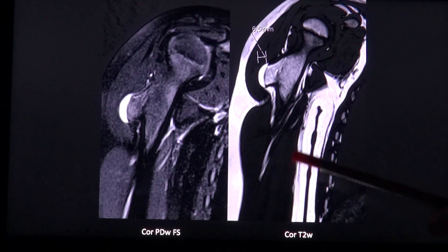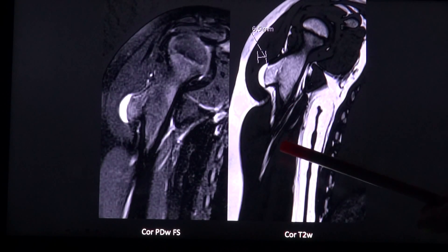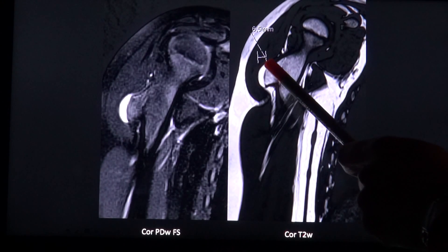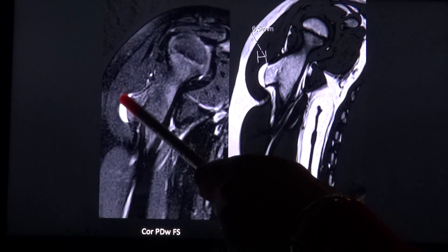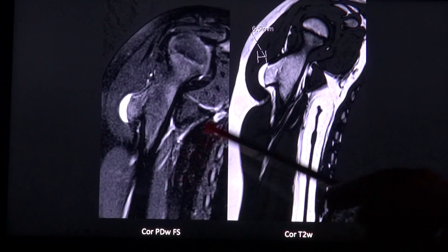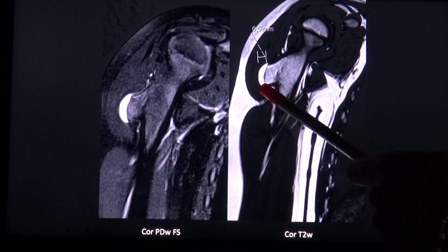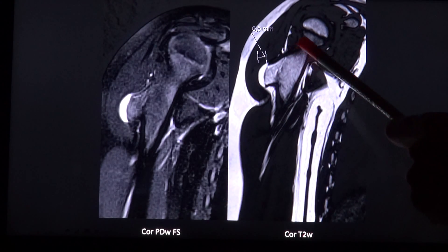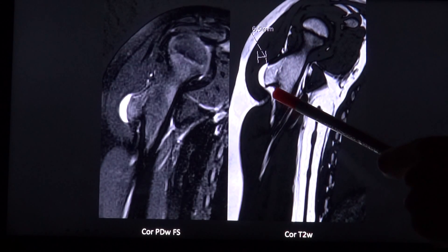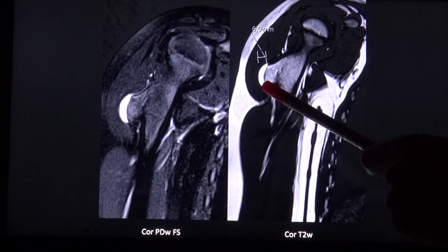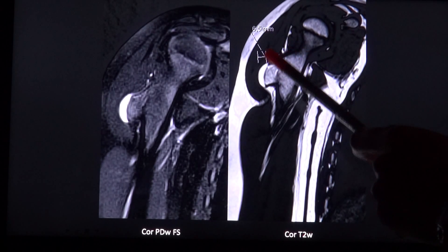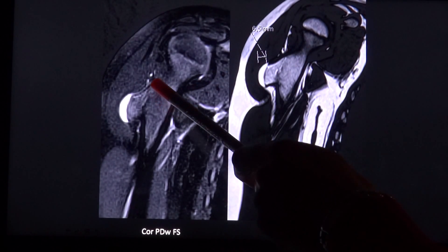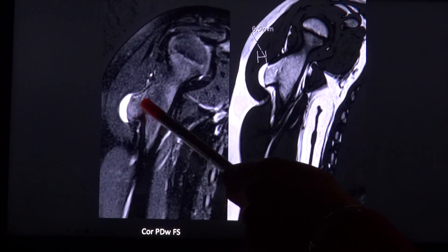With an MRI scan you can better evaluate the cartilaginous cap. Here with a very bright signal on the PD and T2 sequence. You can also very well see the low signal of the cortex and the marrow signal, which is continuous.